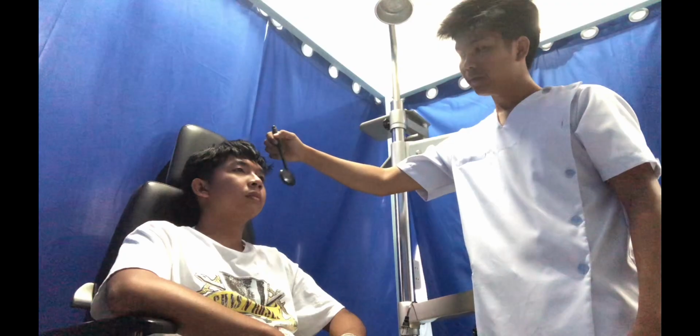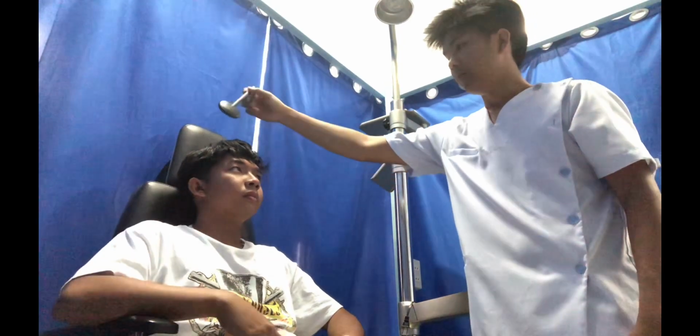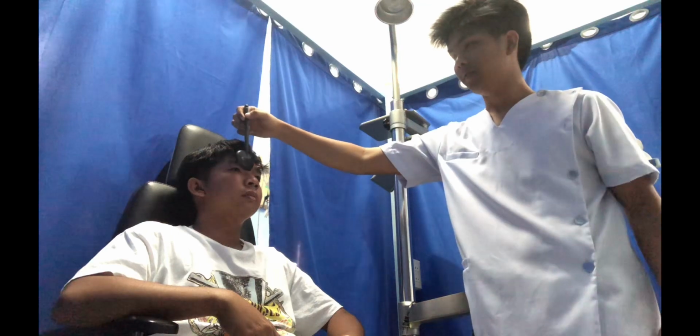The cover-uncover test is useful to identify a tropia and differentiate it from a phoria. The test is done by using an opaque or translucent occluder to cover one eye. The occluder is held in front of the eye for a few seconds and then removed. When the fixing eye is occluded, the examiner will observe the non-occluded eye move to pick up fixation if a tropia is present. If no tropia is present, the non-occluded eye will remain stationary.